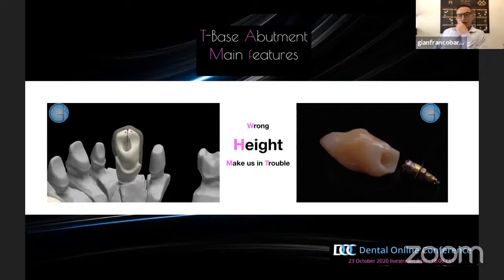This is one of my crowns, from the milling center, and of course after a month we have this result. It is really evident that the height of the T-base is not enough compared to the height of the crown. The bending effect may cause this fracture.